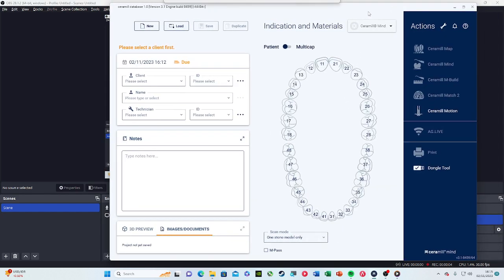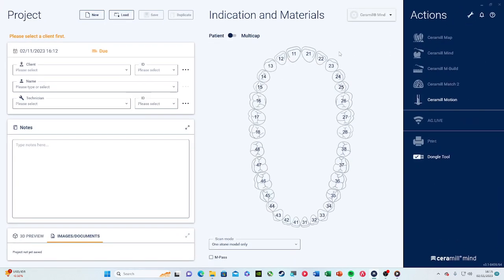Good morning everyone. Today I want to do a demonstration on the digital side of dentistry using the Ceramill Mine software from Armann Girrbach — a simple case of how we import an intraoral scan STL file to the software and how the software uses artificial intelligence to create a crown.